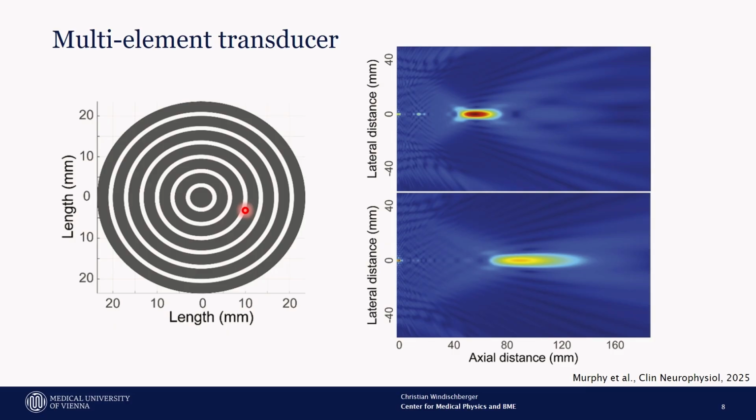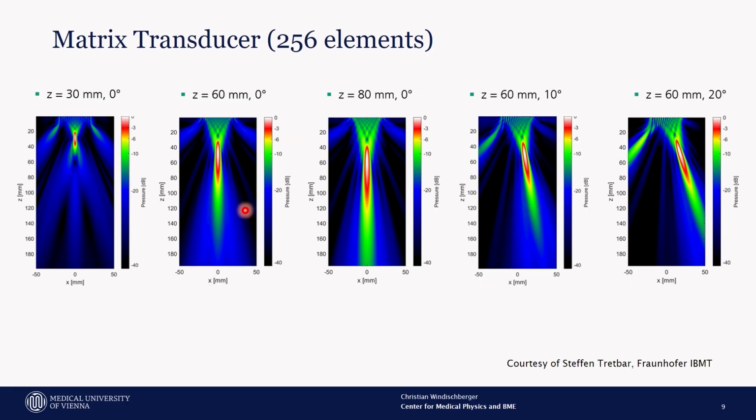And you have the same side effects. You have the same noise, the same impressions on the participants. So that's really quite cool. You can go further than that and not only have these concentric transducers. So this is an example of a 256 matrix transducer, as we are using it in the Citrus project, which we'll see a little later on.